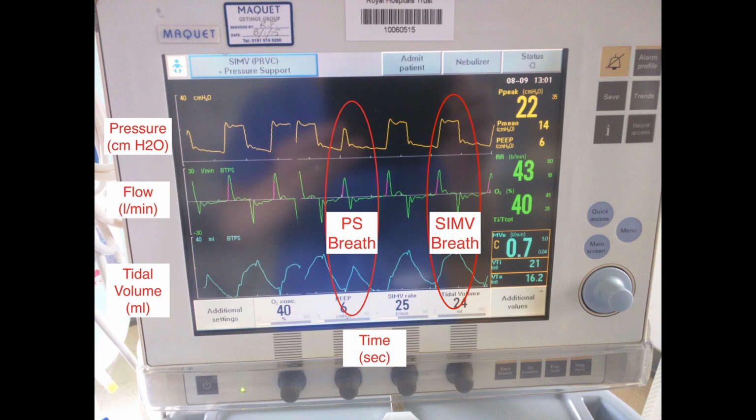If your patient was to have an unplanned extubation, all the flow would be above that horizontal x-axis. There'd only be inspiratory flow. All the expiratory flow would not be coming back through the endotracheal tube, so you'd have no flow below the line. And obviously you should be using capnography to help you work out if your tube's still in the trachea, but it's just another sign you can look for that helps you.